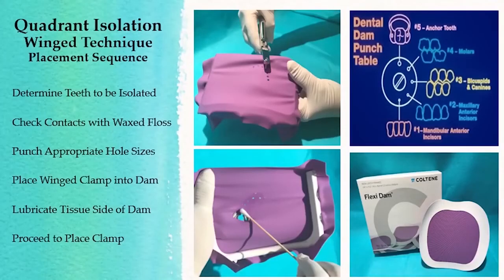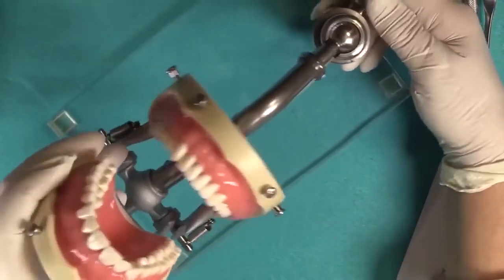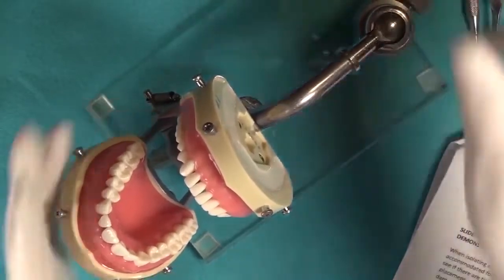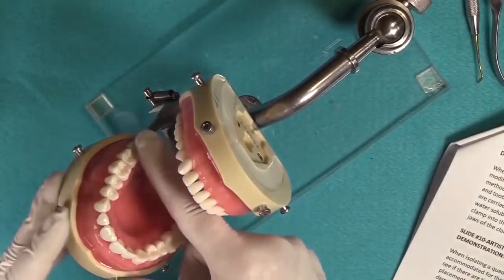When we're using a frame for our quadrant isolation, we're going to isolate the upper arch. So generally speaking, here's what I do. Let's do a run through. Here's my patient. Hello, Miss Patient. How are you today? Okay, I normally check the arch.